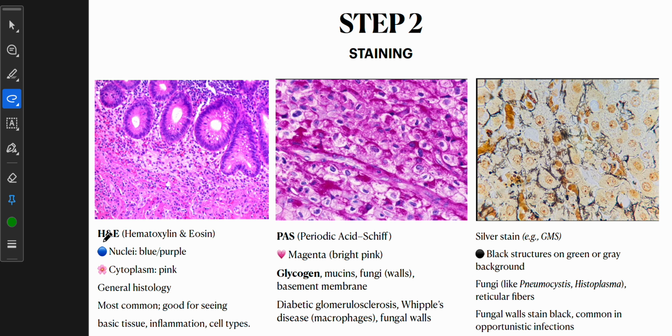In H&E stain, that is hematoxylin and eosin stain, this is the most common staining method, and nuclei appear blue or purple. All these blue or purple things, these dots, these all are nuclei. Okay, that is how you remember. And in cytoplasm, all this pink structure is cytoplasm, and the areas outside of the cells are also cytoplasm, and these dots are nuclei.